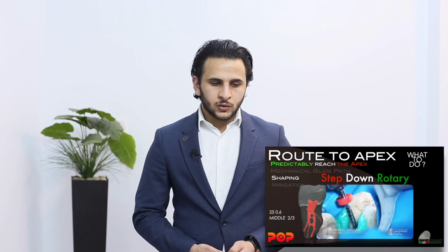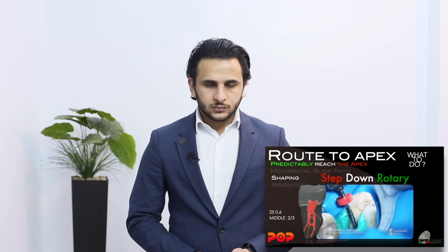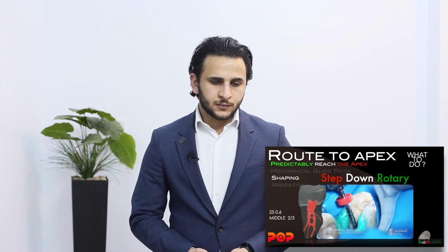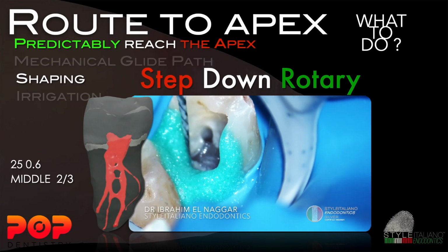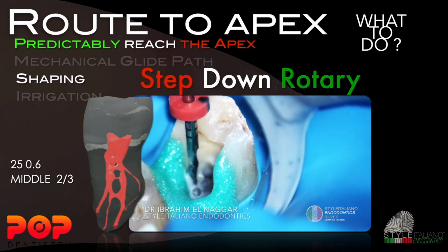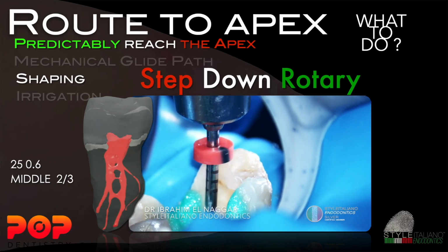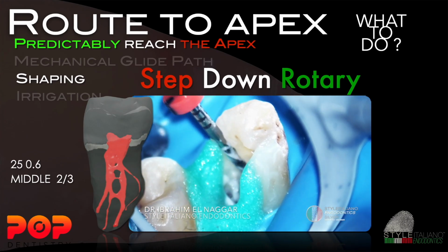Let's see a case. The same case before. I started to prepare the coronal and the middle third of the canal with 25.06 because it was pretty large after the use of the orifice opener. You can see here pre-enlargement of the canal entrances till the middle third. Just remember that the file of the orifice opener has to be limited to the coronal direction.